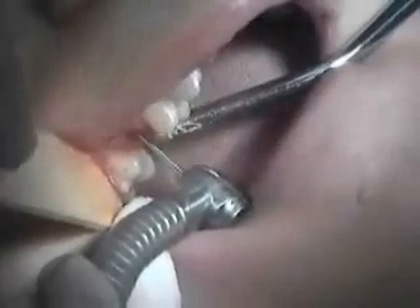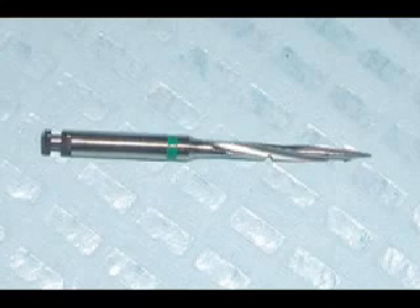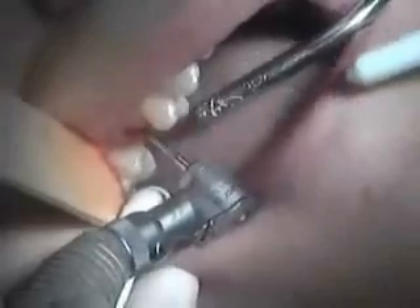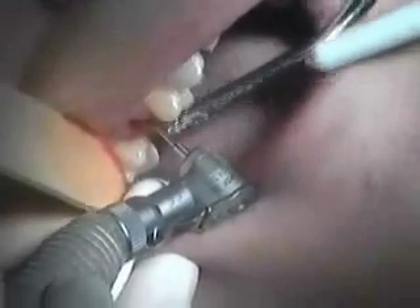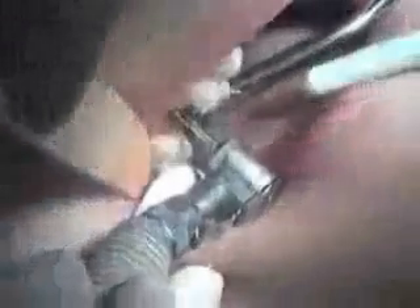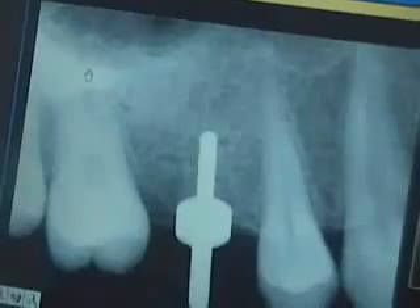So you're going to be using a high-speed burr to just penetrate very lightly right in the middle between the buccal and the lingual roots. The next step is to use a tapered burr, entering the same point just between the buccal and lingual roots, preventing drift into the buccal and lingual areas — because you want it right in the center.